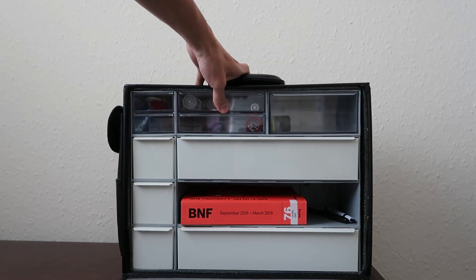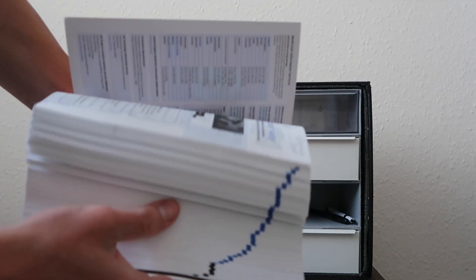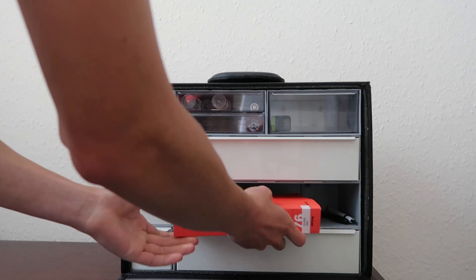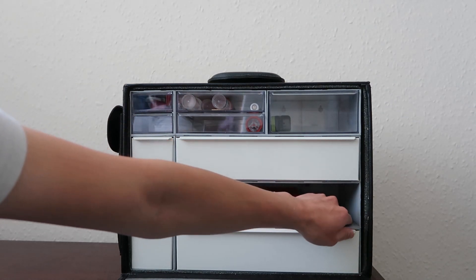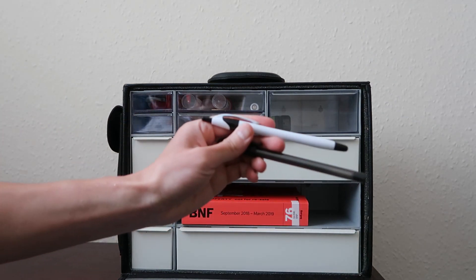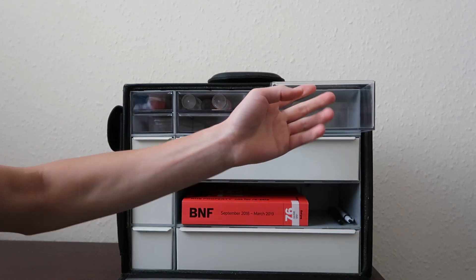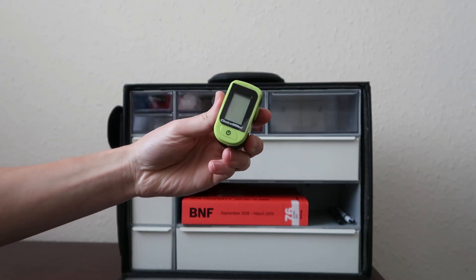Then in the second space we have the BNF. It's usually advisable to carry at least one BNF just in case the BNF app stops working. And then to measure your vital signs and saturation, you have the pulse oximeter.